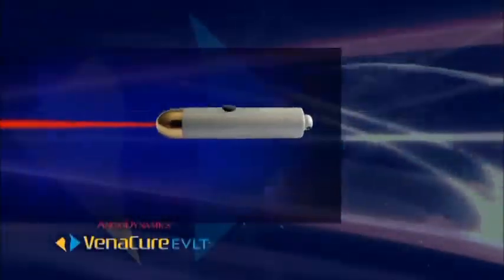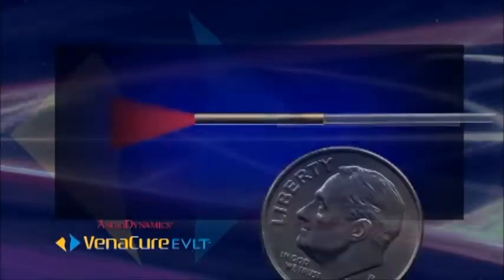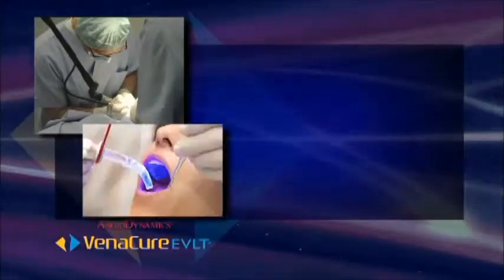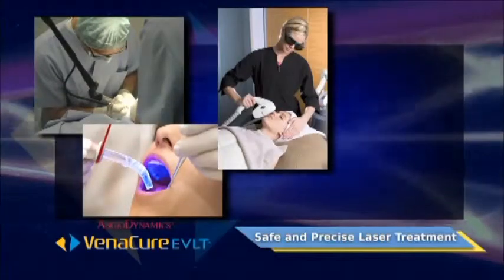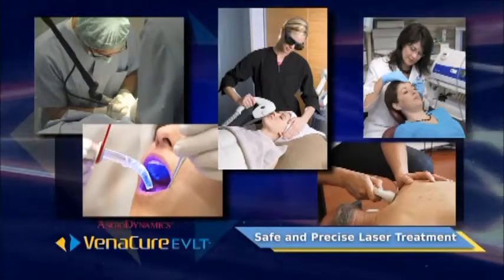It's all done with the same principle that powers something as common as a pointer, a laser. In its simplest form, a laser is a highly concentrated beam of light. Medical lasers work by delivering this light energy to the targeted tissue, and they're being used in all kinds of ways, from eye surgery to dermatology.